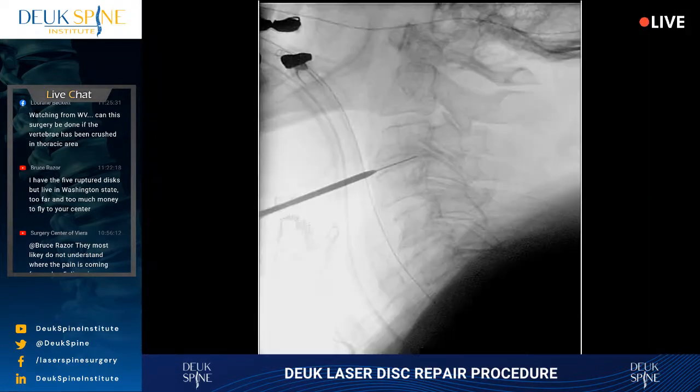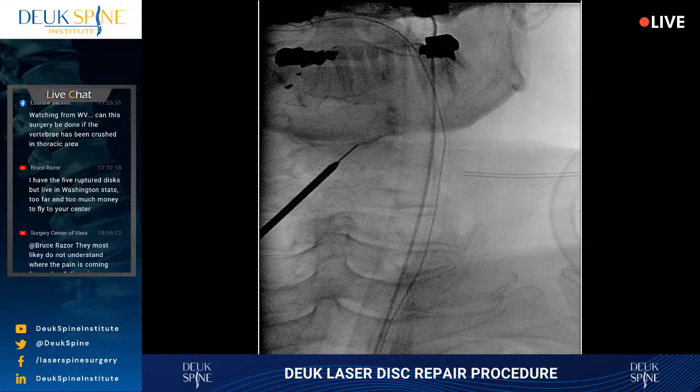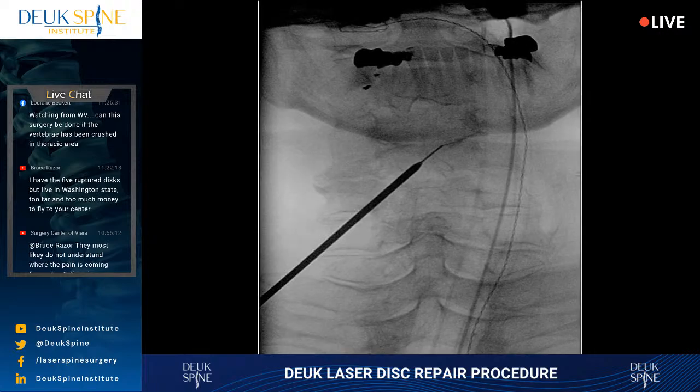What was that? That hit the bottom of the table? Not the top, right? That was the bottom? Shot. It's too far over to your side. It's too far to you. It's too far to you again. All right, it looks perfect in terms of positioning. Very happy. All right, lateral.